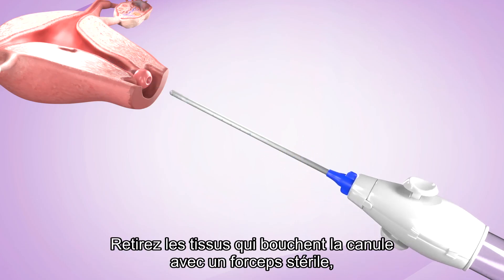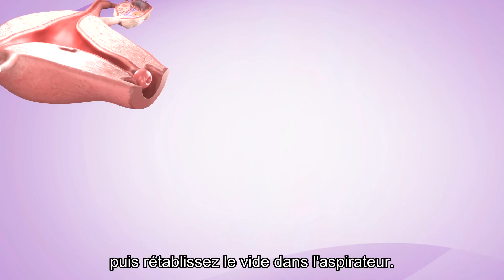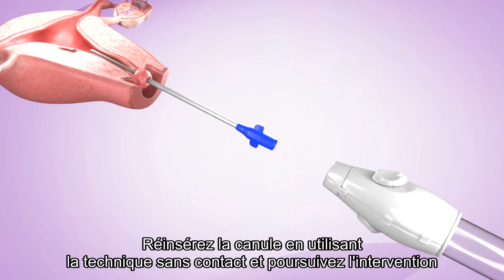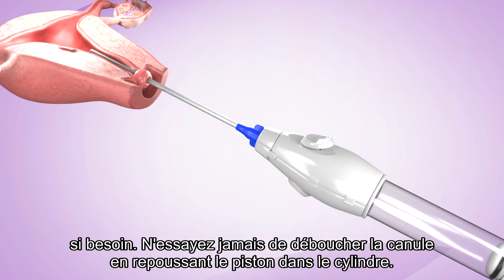Remove the tissue which was clogging the cannula with sterile forceps. Then re-establish vacuum in the aspirator. Re-insert the cannula using the no-touch technique and continue the procedure if required. Never try to unclog the cannula by pushing the plunger back into the cylinder.